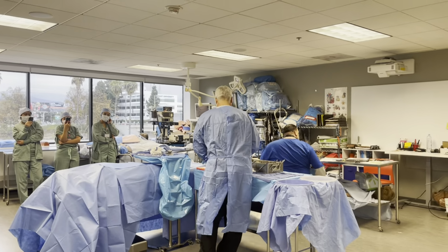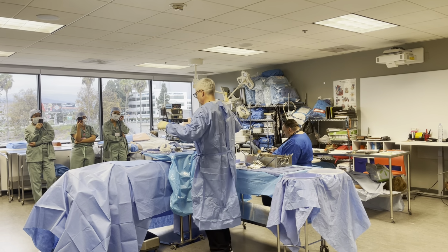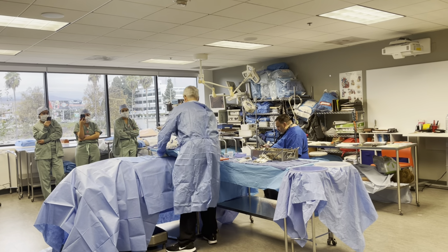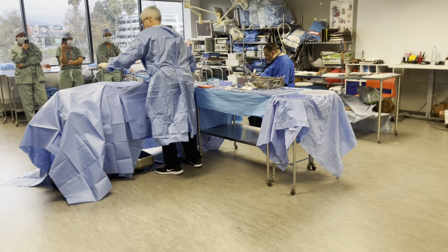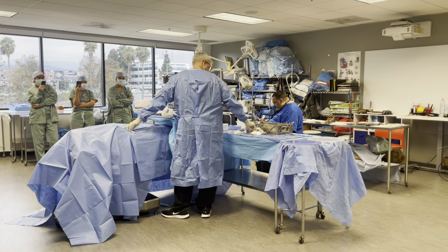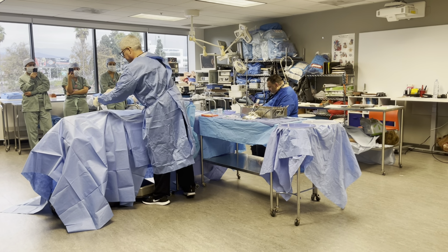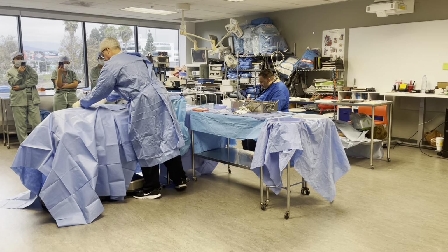So now my doctor's been waiting for me probably. I'm gonna set up my stuff. Here's two things you can do. One, how I do my thing. Or you can take it and try to run it through like that. I usually measure to the head, put it down. I know my surgeon is right-handed. It says so on the preference card. So I'm gonna set that up for him right there.